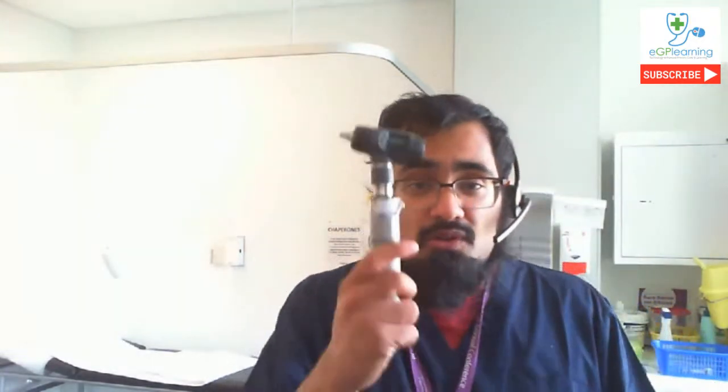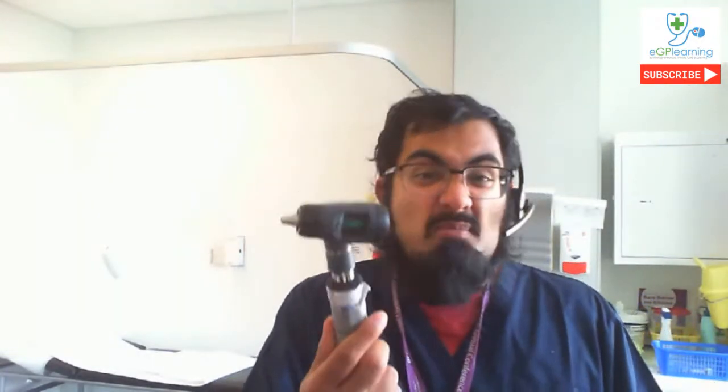But one of the things that you sometimes may want to use is obviously how you can examine the throat effectively in your practice. Now, obviously, many of us will use something like this, a bog standard otoscope. I say bog standard, this is my favorite otoscope. I've had it for coming up to 10 years now. Welch Allyn 9650B, I think it's called. And the reason why I like it so much is it's got good heft on it. It works really well. It's even got one of the crosshairs in the middle, but it's also got the cobalt blue light for when I use the ophthalmoscopic head.